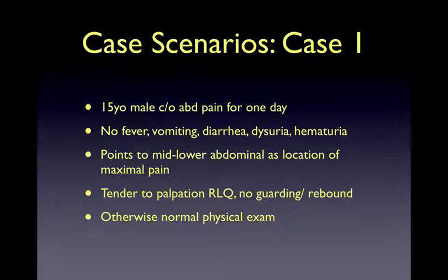Let's assume this kid is your typical skinny teenager. In many ways, he would be the perfect candidate for bedside ultrasound diagnosis of appendicitis. He's got the ideal body habitus. He's able to tell you where it hurts. He's able to hold still during your ultrasound exam, and you don't have to worry about any intrapelvic organs.